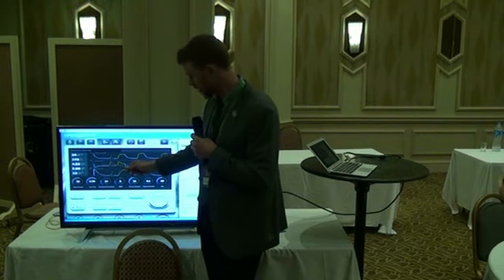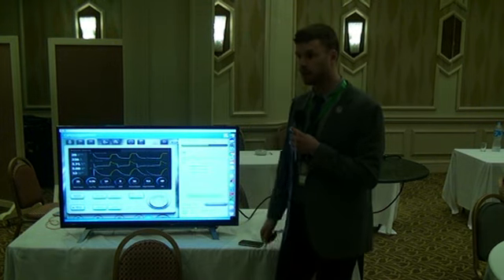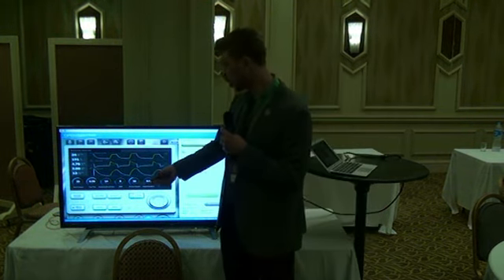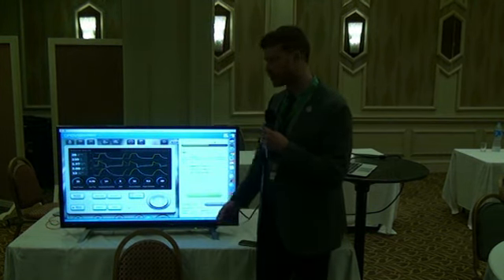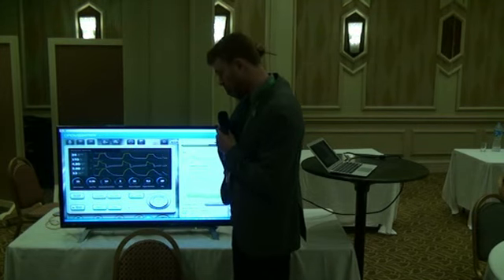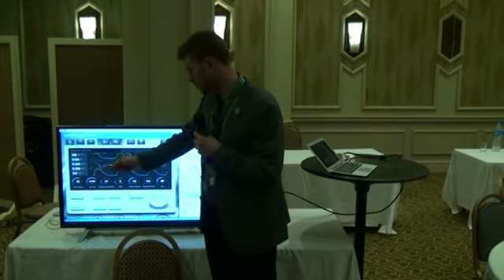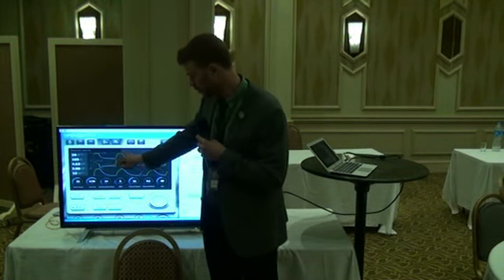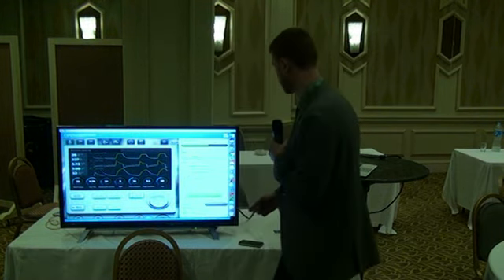We see it comes back and doesn't reach baseline before the next breath is initiated. So if we were to do an auto PEEP, we would probably find that the total auto PEEP is higher than the actual PEEP, and that would be a function of the airways obstruction. All right, so that's pretty much the problem. The other thing that you can see sometimes, but it's not really that important because the easiest is on the flow waveform, is it just takes a while for the volume to get back to baseline. But we don't really care about that so much.